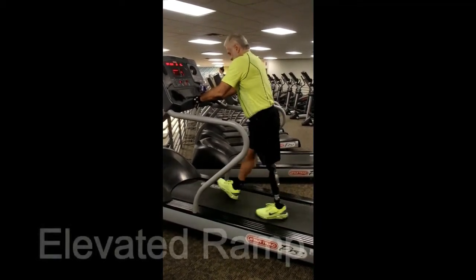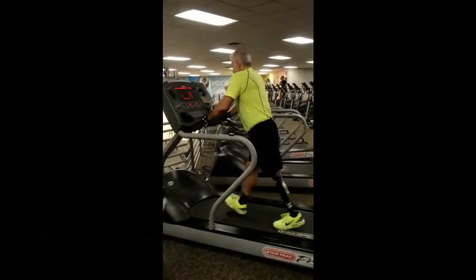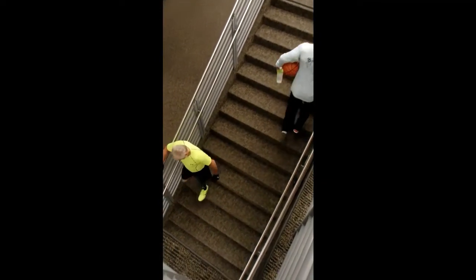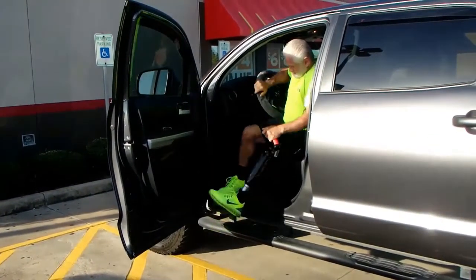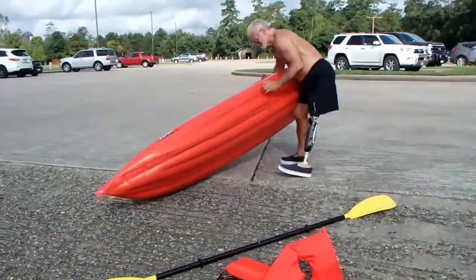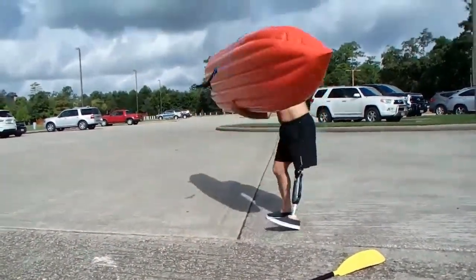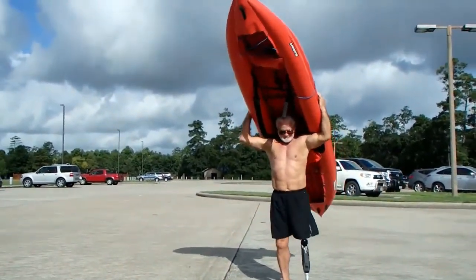in these countries that have uneven terrain, dirt, wet, bad weather, bad environment, everything that you don't want to do with electronics. But they need this because of the world they live in. They don't live on nice, flat, ADA-type streets. They don't live in clean areas. They live where it's dirty. So his goal was to develop a knee that gave them incredible stance stability, easy walking, and would tolerate poor conditions. And I think he's achieved this.